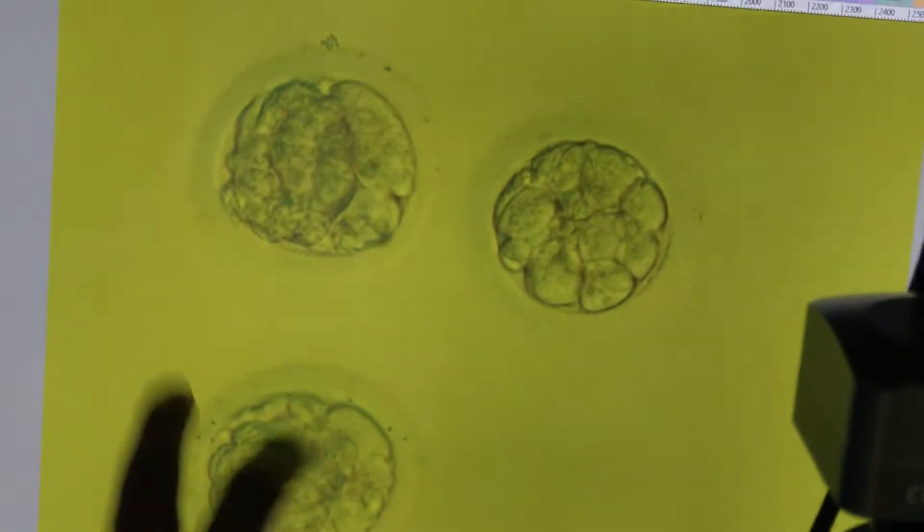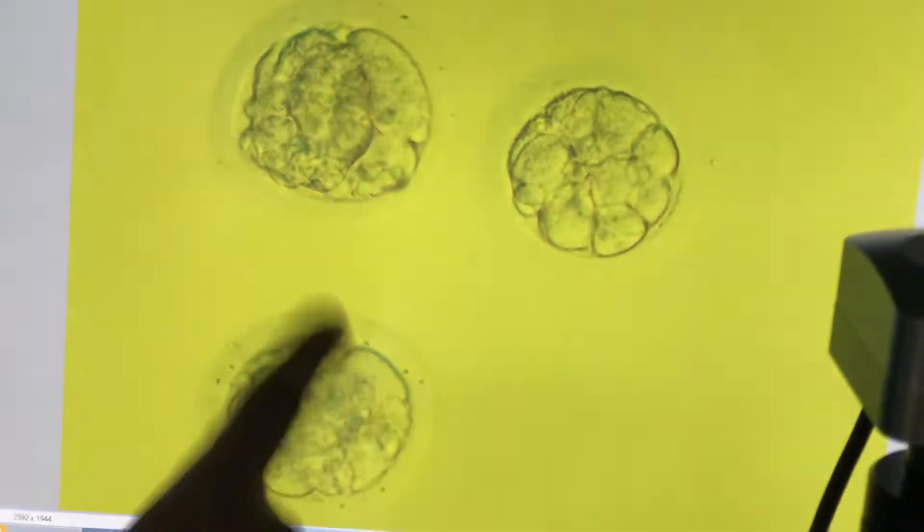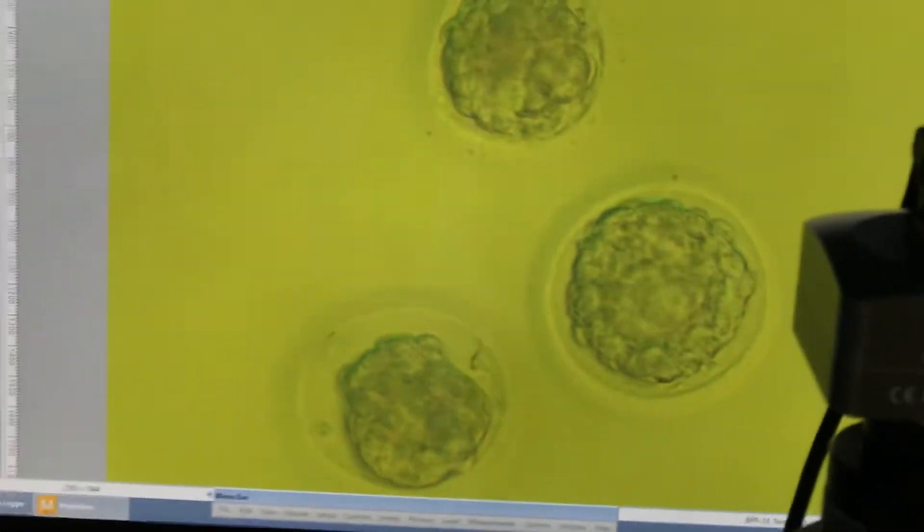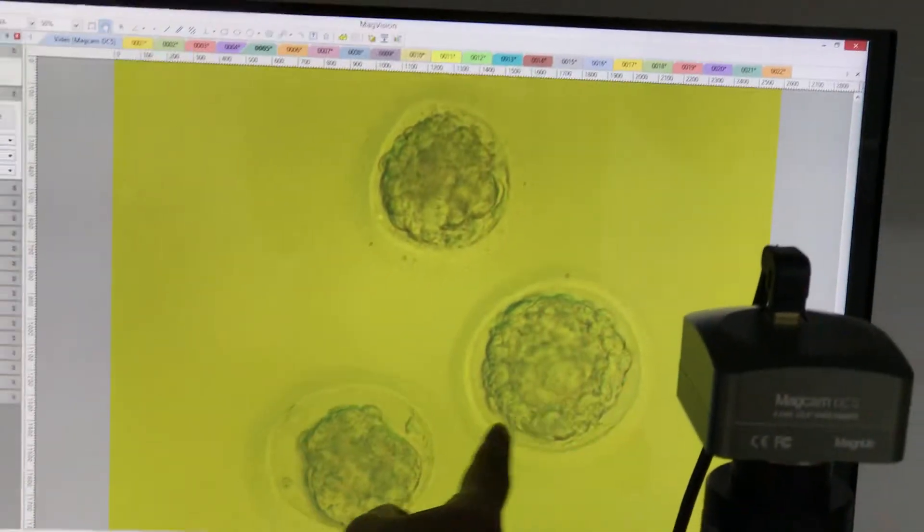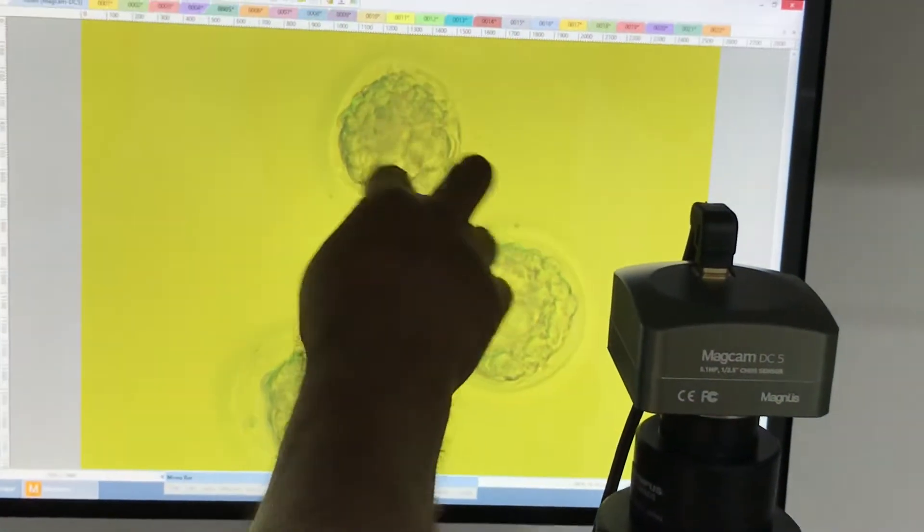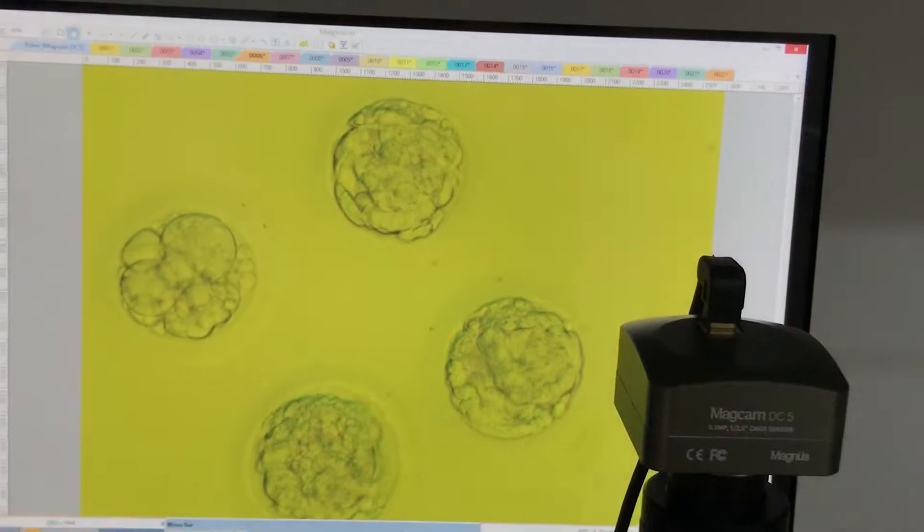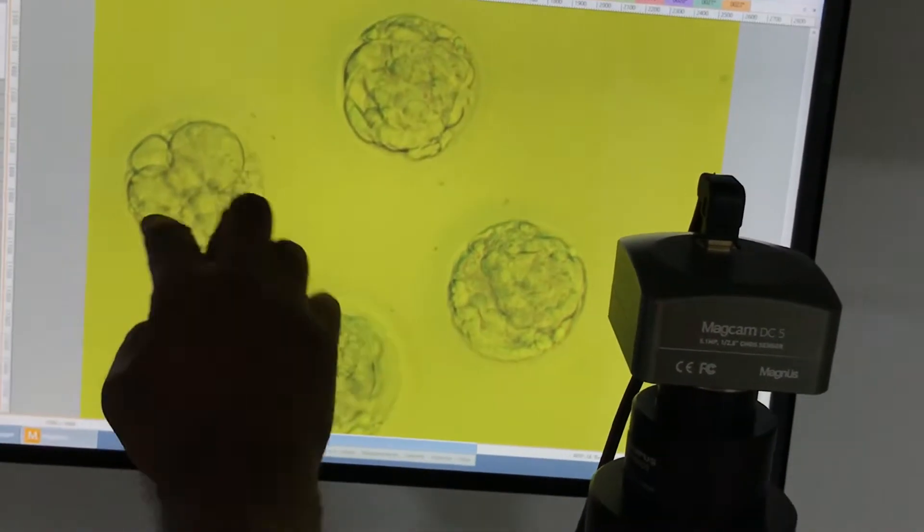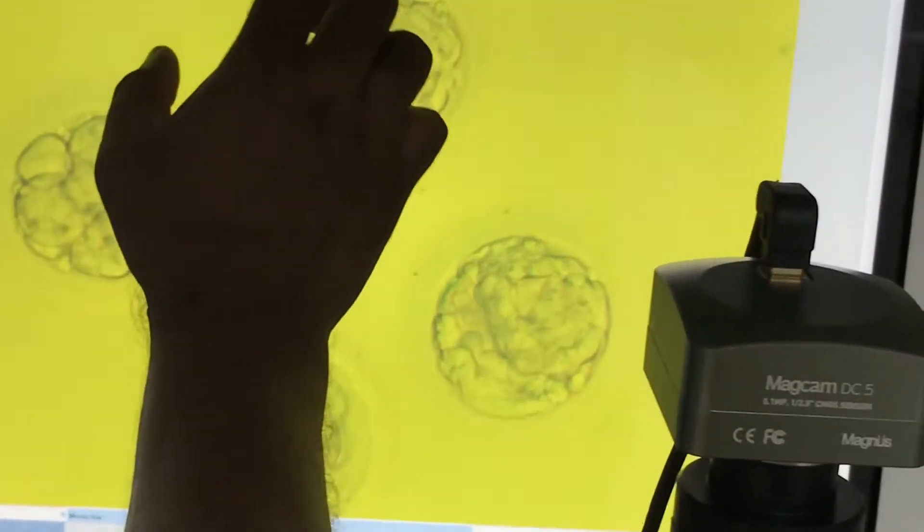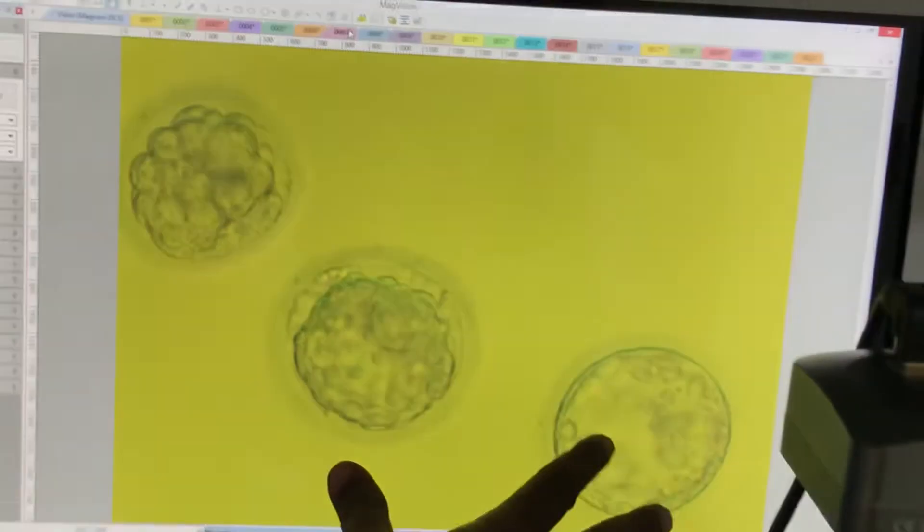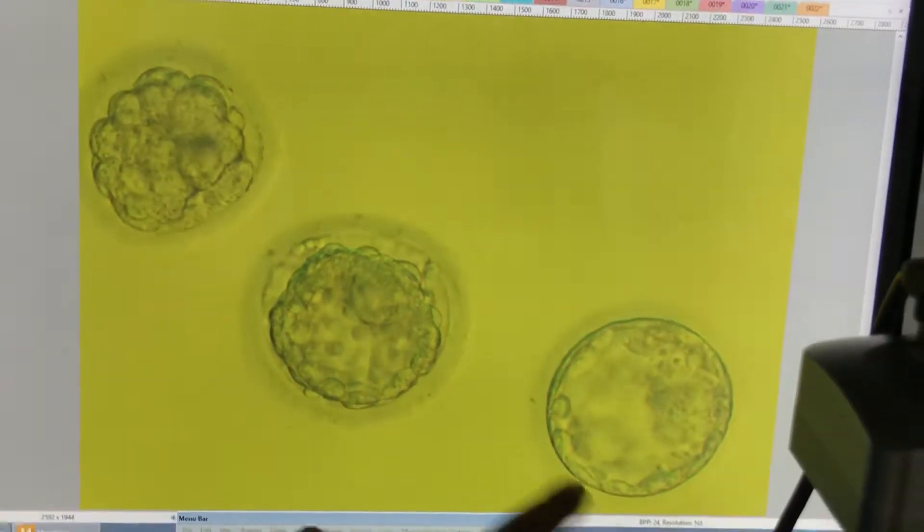Patient number three has two good embryos. Patient number four has two early blasts - this particular case is a little bit slow. Patient number five looks like a 4A, but with lower grading. Patient number six has three good embryos, though this one is a little bit slower.